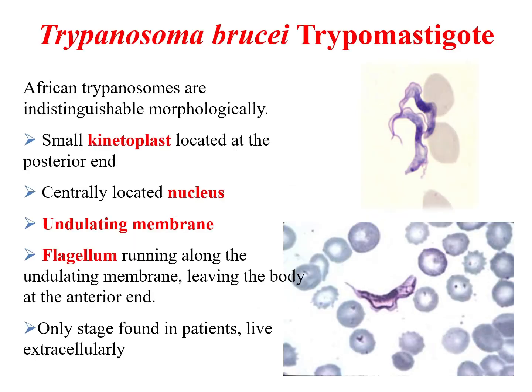Let me start showing you some pictures of trypomastigotes of African trypanosoma, which are Trypanosoma brucei, whether gambiense or rhodesiense. So as you can see, these trypomastigotes have this undulating membrane that has the flagellum covering the full surface of the stage. You cannot distinguish between trypomastigotes of brucei gambiense or those of brucei rhodesiense. Note that these are trypomastigotes. This means that the kinetoplast is always at the posterior side as compared to the nucleus.